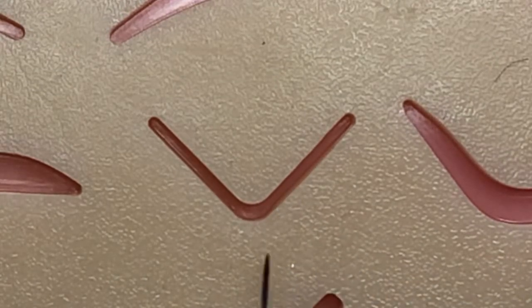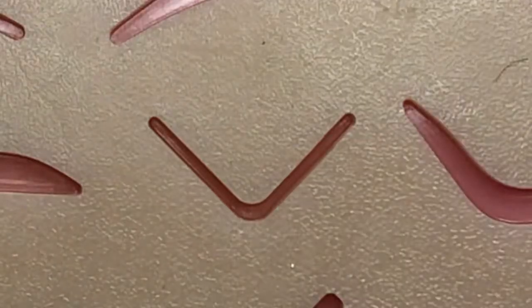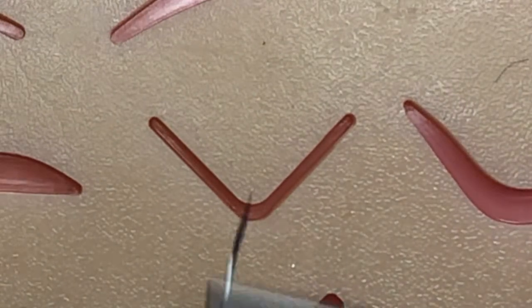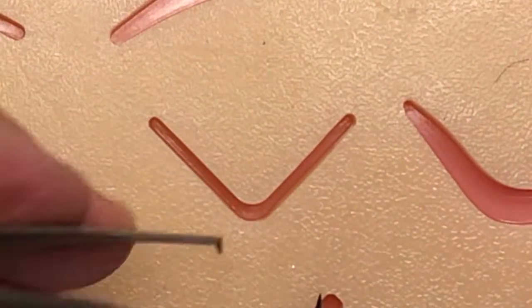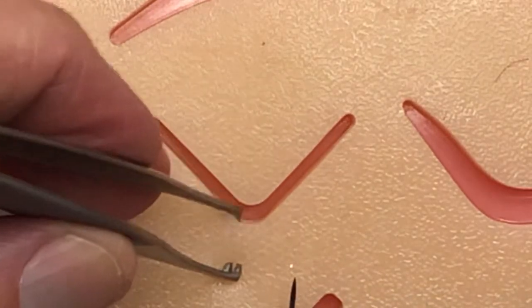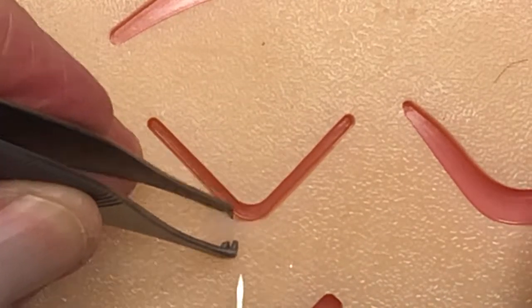So we're going to do two things here. First of all, we're just going to do a simple stitch at the apex of the wound. And again, really try to use your tissue forceps for manipulating the tissue and the needle.